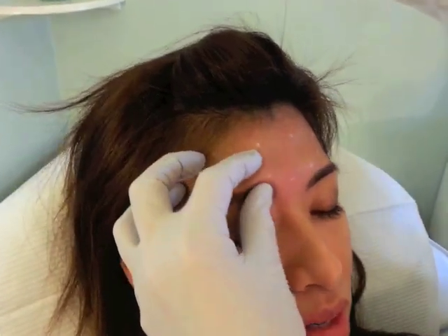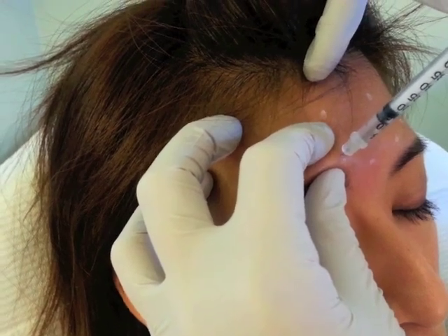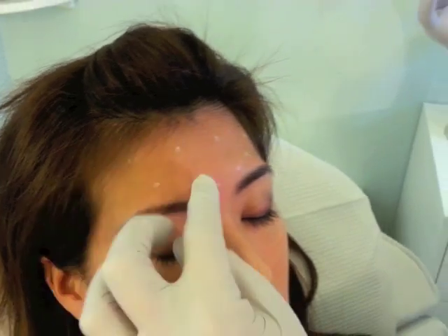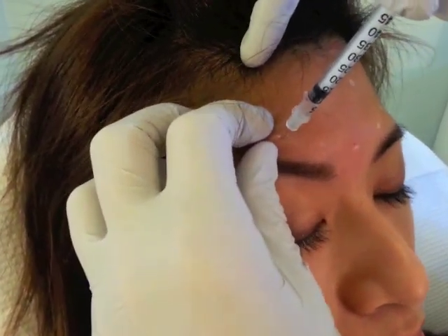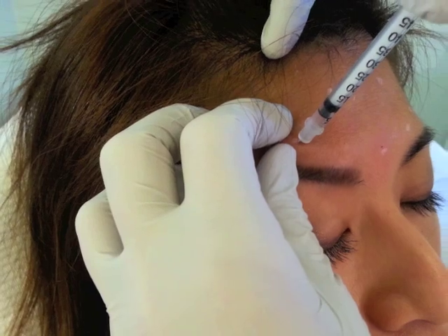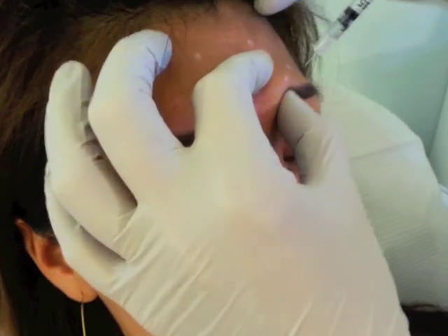How was that? Just a slight pinch. Good. So this is coming into the very beginning of that corrugator muscle, and this is what most clients are mainly concerned about — it causes those lines right in between here. We do both the beginning and the end of that muscle. Doing great, nice and still. Now we'll come to the other corrugator.